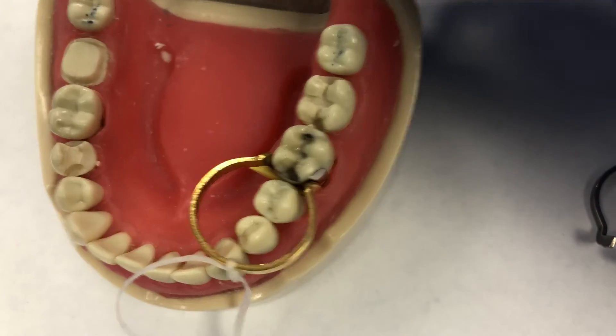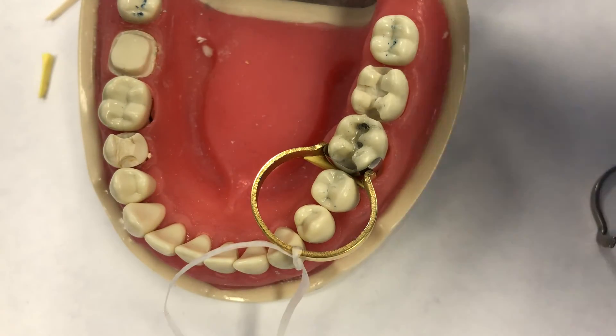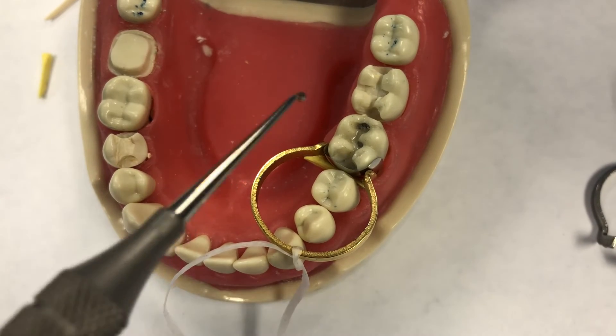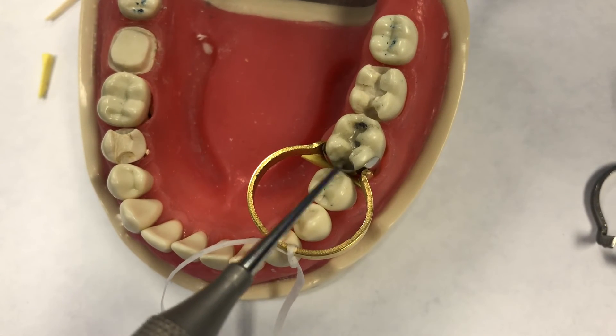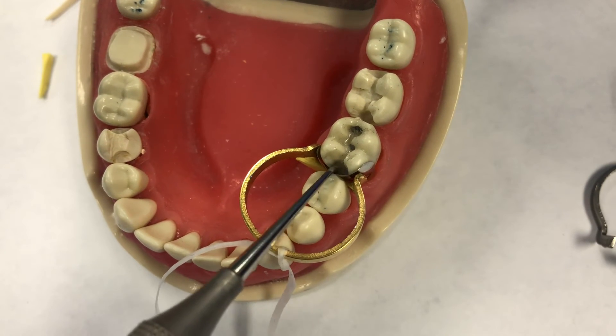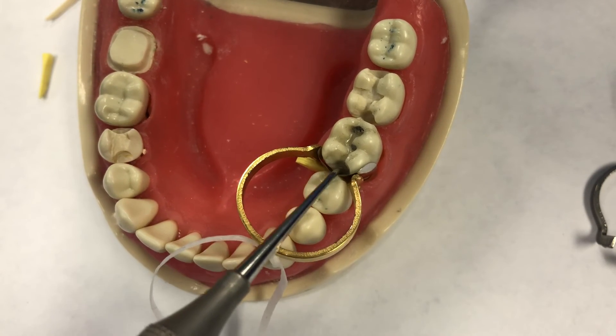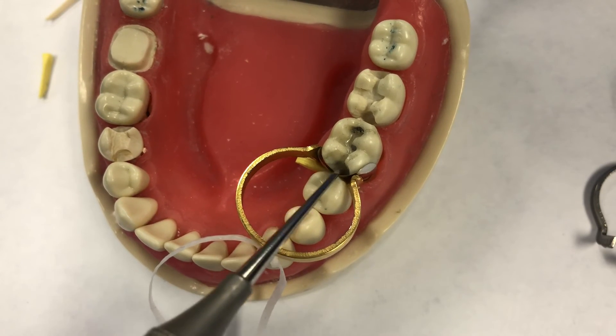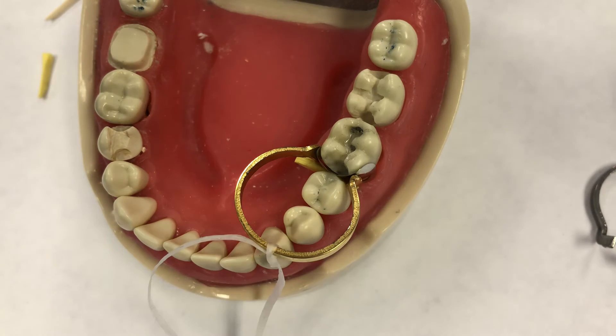One last step before the filling can be placed: take a burnisher — doesn't matter what shape, ball, football, or acorn — and burnish the matrix against the neighboring tooth. By burnishing, it'll create a nice snug contact. If you notice your ring slips out, you can reposition it.